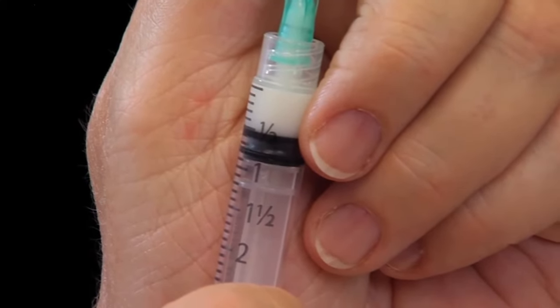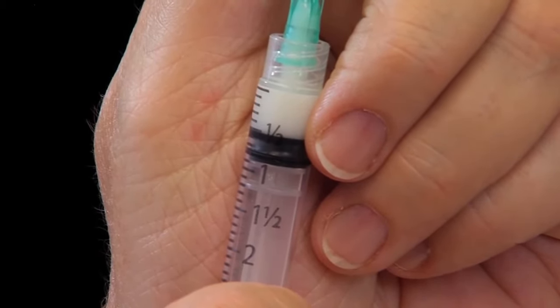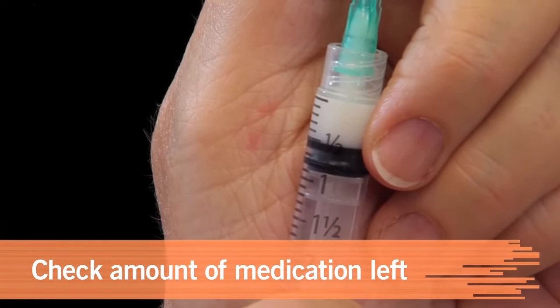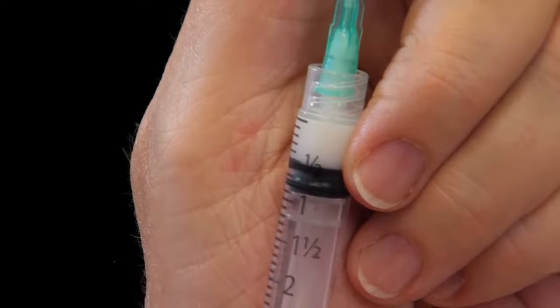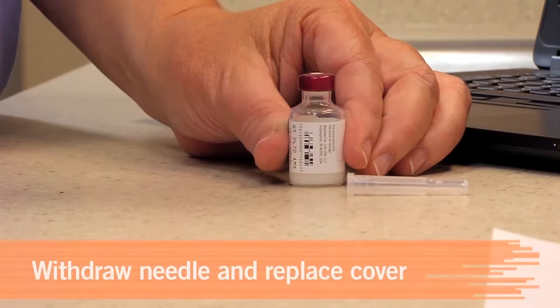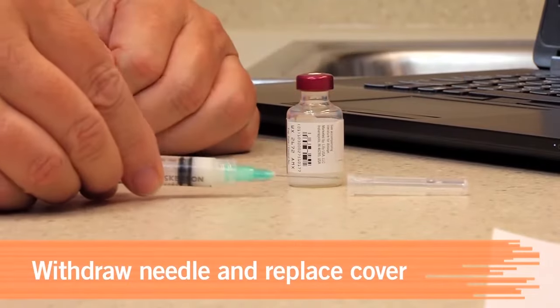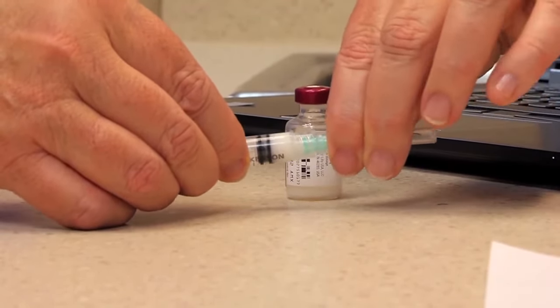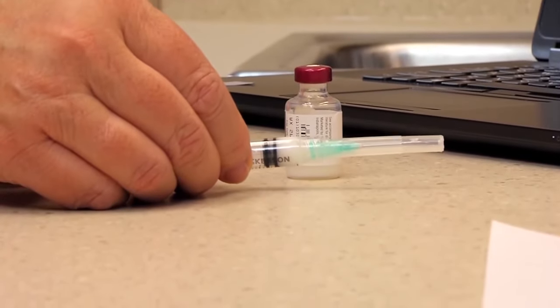Still holding the syringe and vial at eye level, make sure the amount of medication in the syringe unit is still accurate. This confirms that the right dose has been drawn up. Using the right technique, withdraw the needle and replace the needle cover. Be careful not to let the needle touch anything, including the outside of the cover.